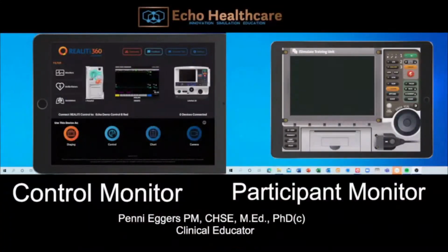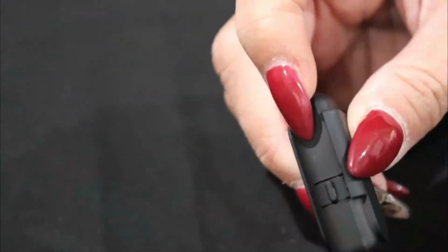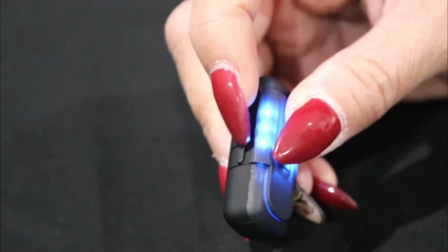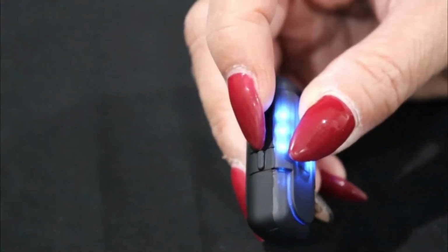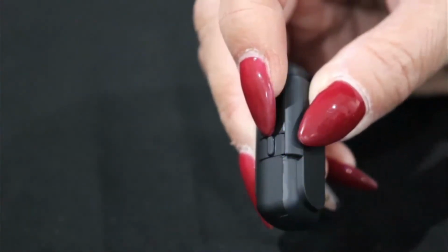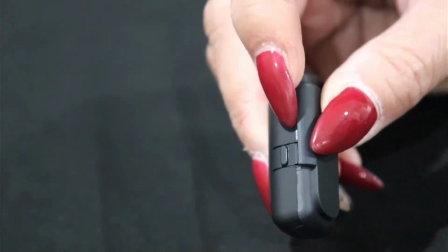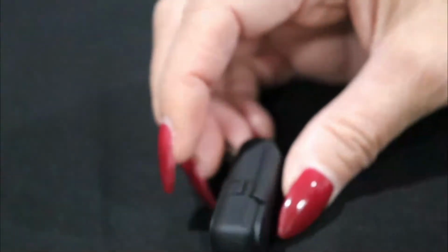So we're just about ready to start our scenario using our CPR bands, but just to recap, to make sure your CPR bands are on and ready to go, I'm going to make sure that I've turned my CPR band on. You can see I have the module here. You have the three blinking lights ready to go. In order to turn it on, again, you just hold and depress this tab. The first mode that it comes up in is going to be a metronome. The second mode, if you continue to hold this, is going to be ready to Bluetooth and connect. So we're ready to connect.